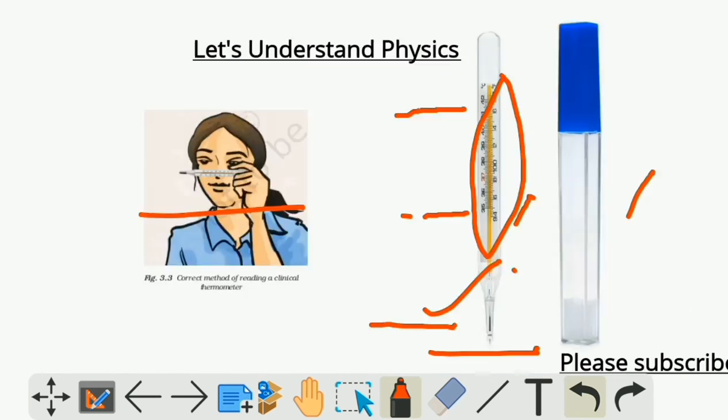Okay. The thermometer has a liquid. Here we are using mercury. Some thermometers are used with alcohol also, that means colored alcohol, where some color is mixed with the alcohol. Why are we using mercury or alcohol? Because they expand uniformly with the rise in temperature. That means if there is a 1 degree rise in temperature, there will be some limit of expansion. In the same way, for the next 1 degree rise also, the expansion will be the same amount.